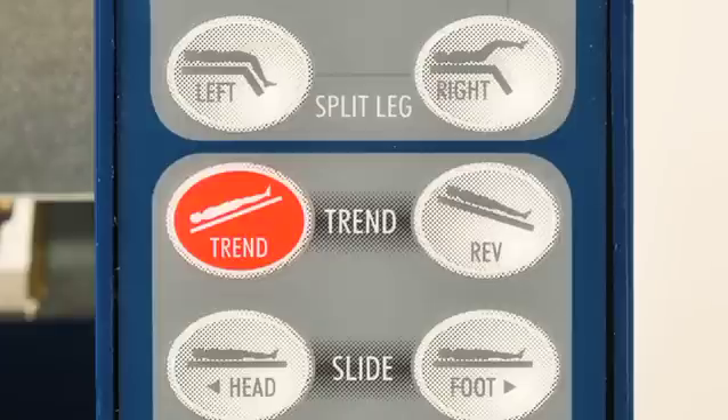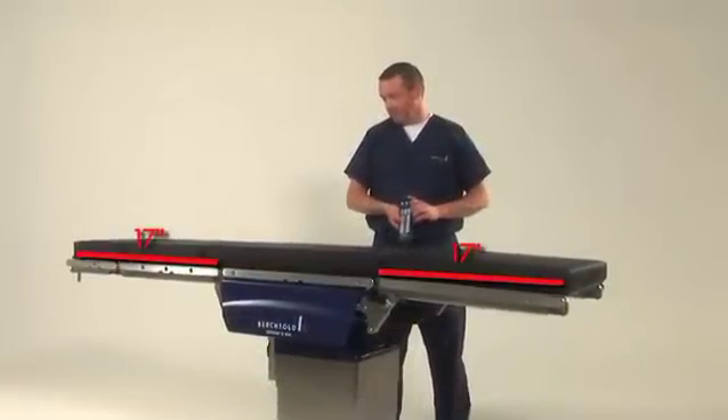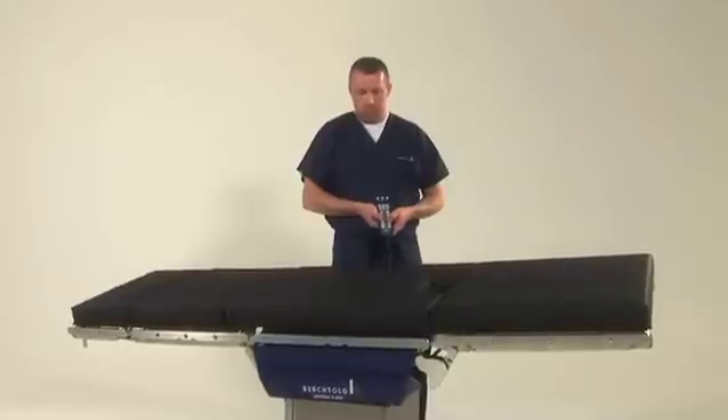Trendelenburg is always indicated in red, with reverse Trendelenburg just to the right. The table's motorized slide capability allows the patient to be moved 17 inches forward or backward. Additionally, the table allows lateral tilt to the left or right.